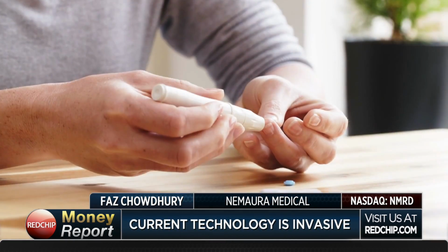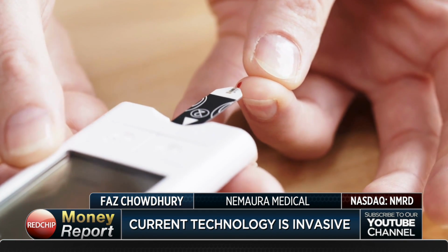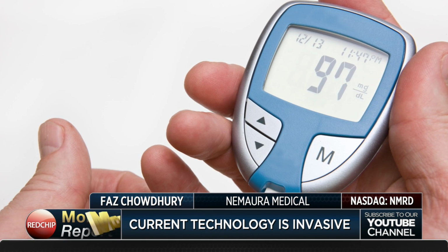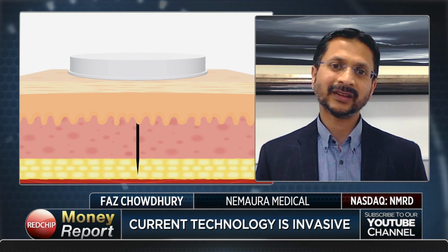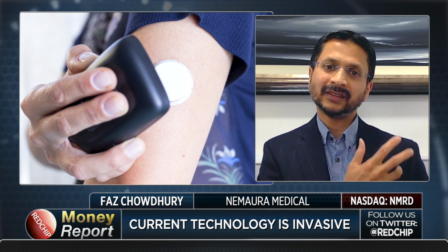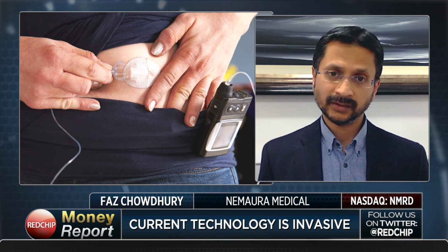Currently, there are two ways of measuring blood glucose levels. One is by finger pricking, taking a blood sample and applying it to a sensor, and then you read a level intermittently throughout the day. The other is where we have continuous meters, notably the Dexcom and the Abbott Libre. In both instances, you have a sensor that is inserted inside the skin, so subcutaneous, and the device then sits on top of the arm for the duration of wear, which can be up to 14 days in the case of the Libre.